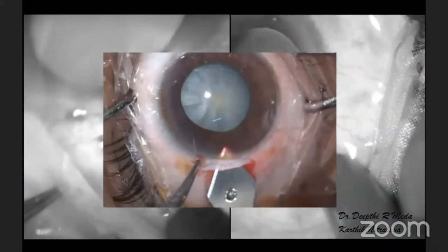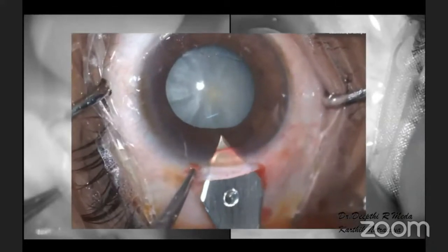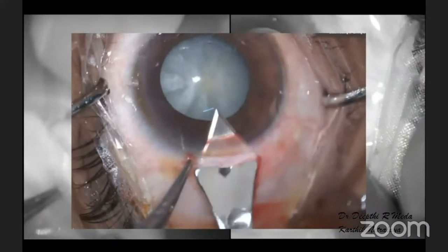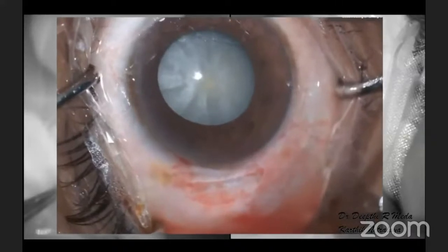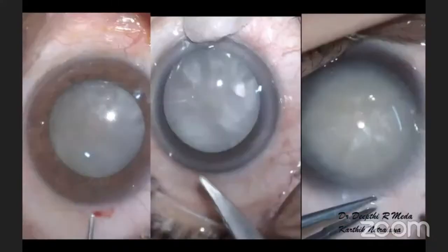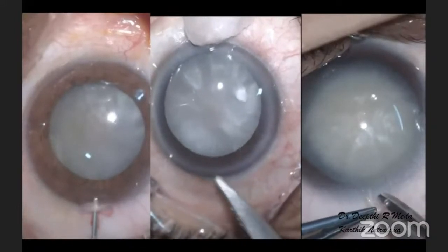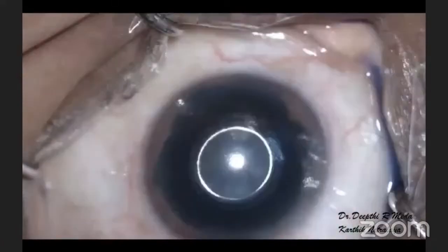It has the small incision and lower SIA advantage of phacoemulsification, and the manual, machine-free, phaco-energy-free advantage of conventional SICS. So this is the 5.5 to 6 mm incision in a typical phacosection. Obviously, to remove any nucleus through this incision we need to fragment it. So today in this video I would like to demonstrate different ways of performing the fragmentation in an advanced cataract.